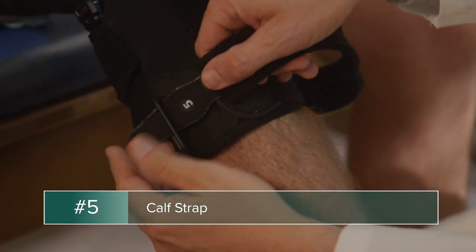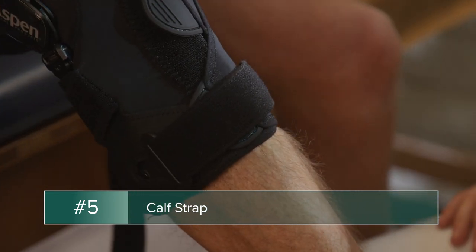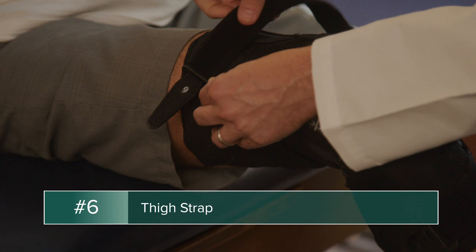After the upper thigh is secure, pull the calf strap through the buckle and ensure it is snug. Repeat this step for the thigh strap.